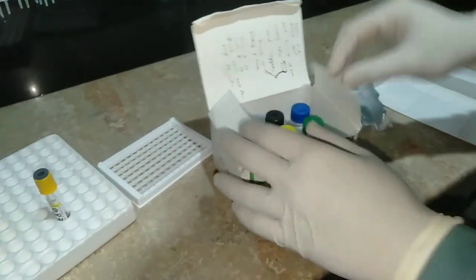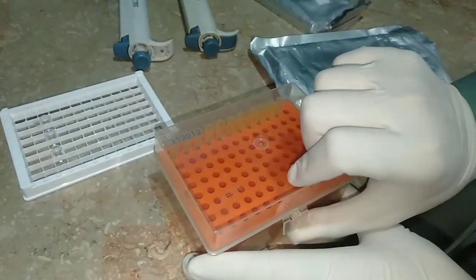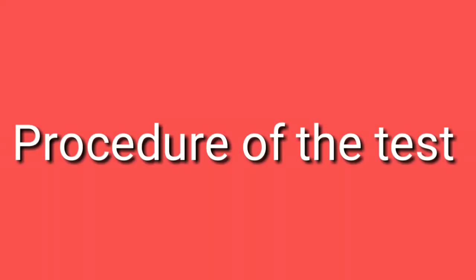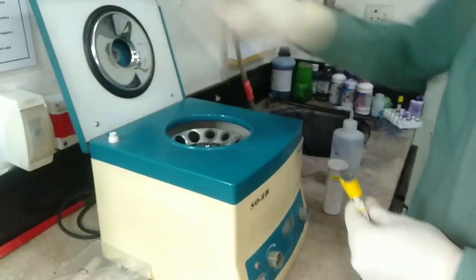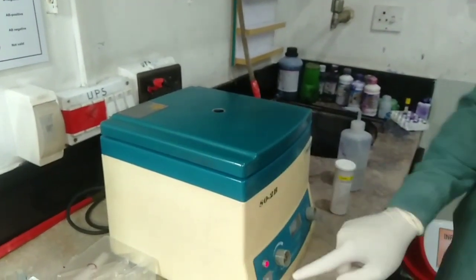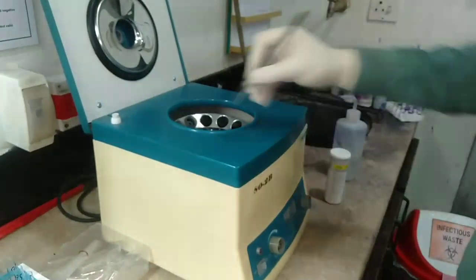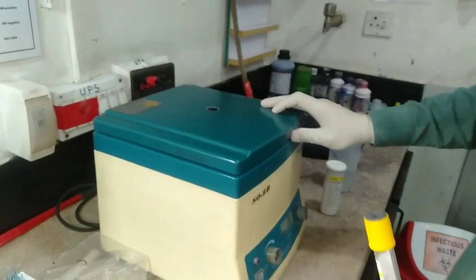The kit also contains a positive control and a negative control — both are used to validate the test. We also need a micro pipette and tips. For the procedure, first we take human blood into a gel tube and centrifuge it in the centrifuge machine for about one minute. After one minute, we get the serum — the yellow portion, as you can see.